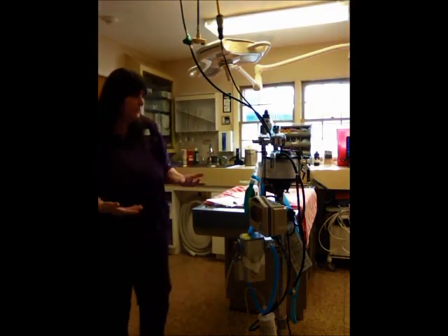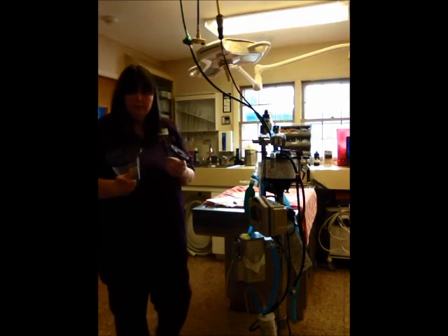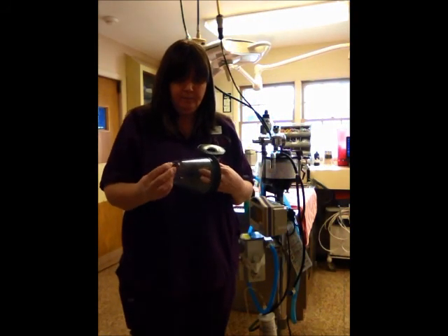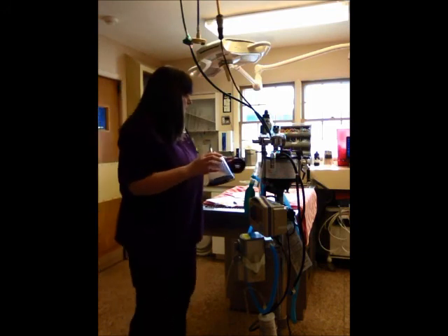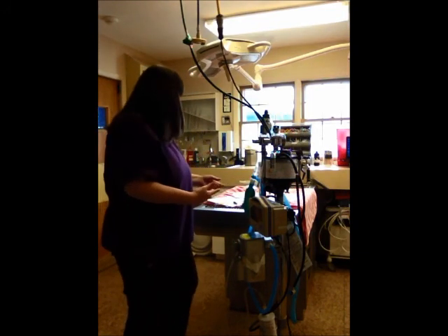Some of the other things that we'll use for inducing anesthesia will be possibly a mask if the patient isn't down enough for intubation. You have the cat or small animal mask and a larger dog or small animal mask. They can also be used to help the patient breathe if they're having difficulty while they're here.